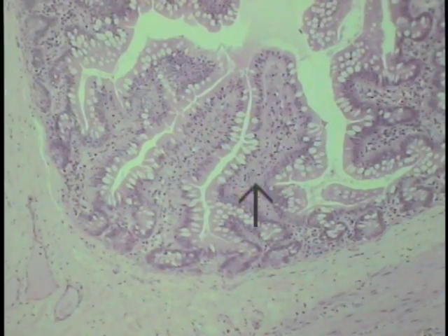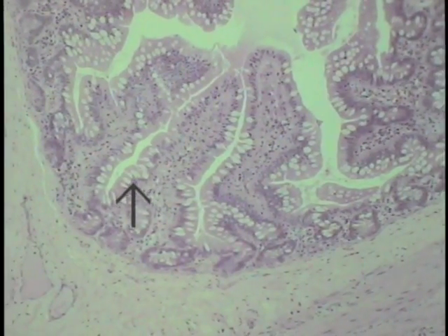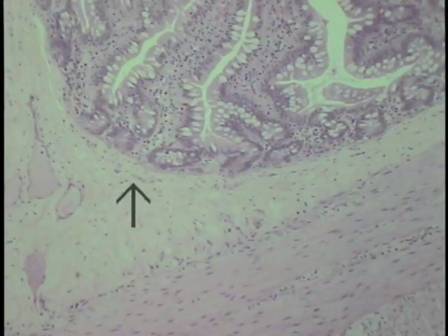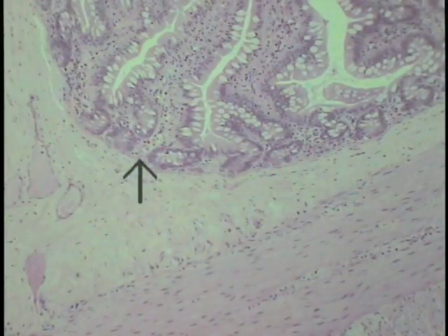Once again, the lamina propria forms the core of the villi and surrounds the intestinal glands, or these crypts of Lieberkuhn. Note also, as one goes downstream, or distally, the increase in the number of goblet cells. Enteroendocrine cells and enterocytes will still be prevalent, but the goblet cell catches one's eye as they dramatically show an increase in number. The muscularis mucosae is shown, it's quite thin, showing right at the tip of the arrow.